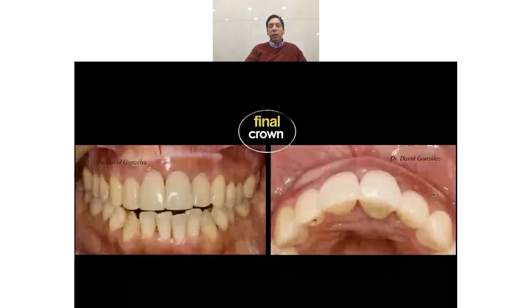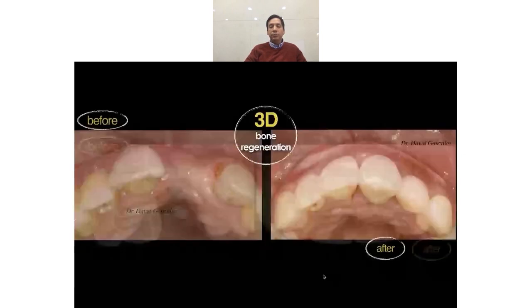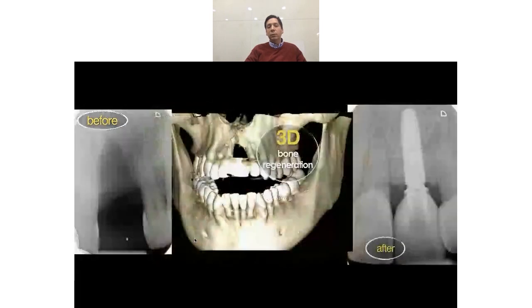This is a frontal view and an incisal view. We see the screw in here. We didn't invade the palate area and we didn't invade the incisal edge. So the implant is in the optimal three-dimensional position. We see the before, remember the recessions that we had, no bone in here, and the final result. The before and the after. All this tissue is regenerated, is new. Before and after, another view. Remember the bone defect and see the radiopacity of the newly generated bone.